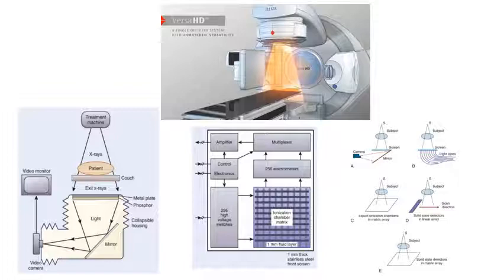Liquid ion chamber systems, as shown in the bottom middle, significantly improved image quality and were also able to be used as dosimeters, allowing the detector to be used to measure patient exit dosimetry. These systems were also eventually replaced with amorphous silicon detector systems, which are fully solid state, low noise, and high imaging efficiency, which means high detector quantum efficiency, and are fully digital. These are the standard MV imaging devices sold commercially today.